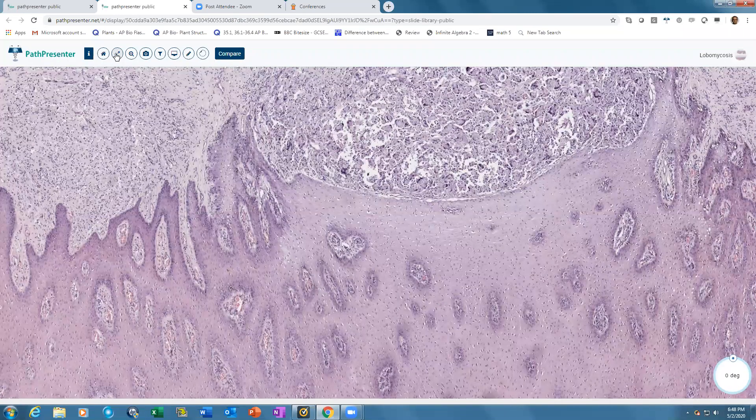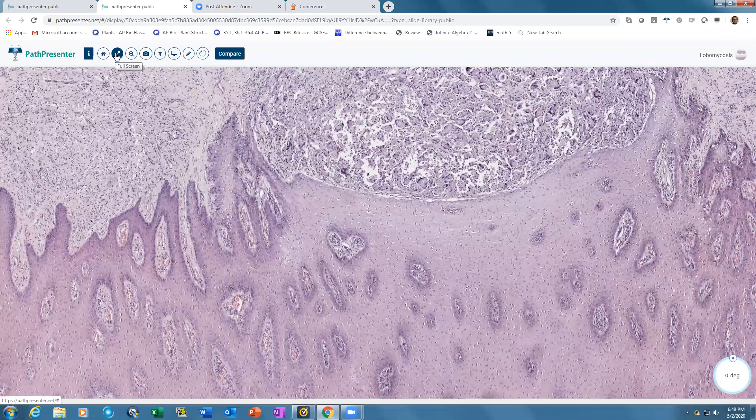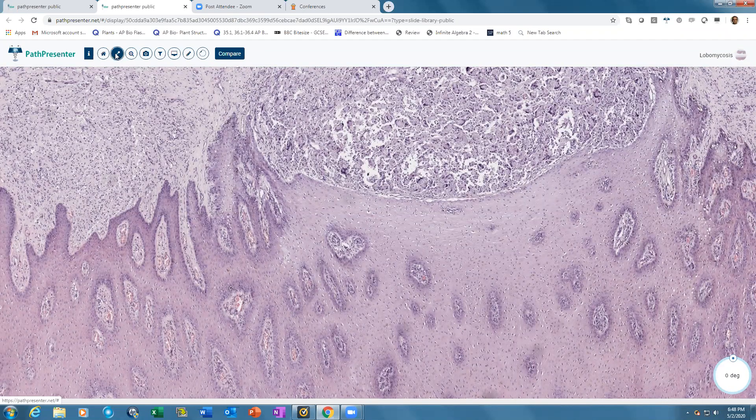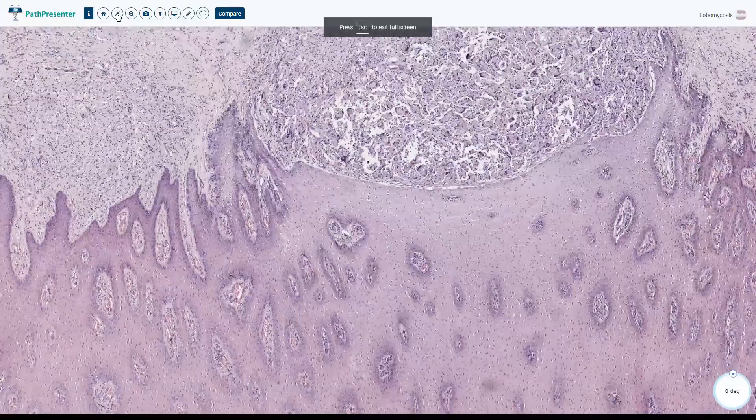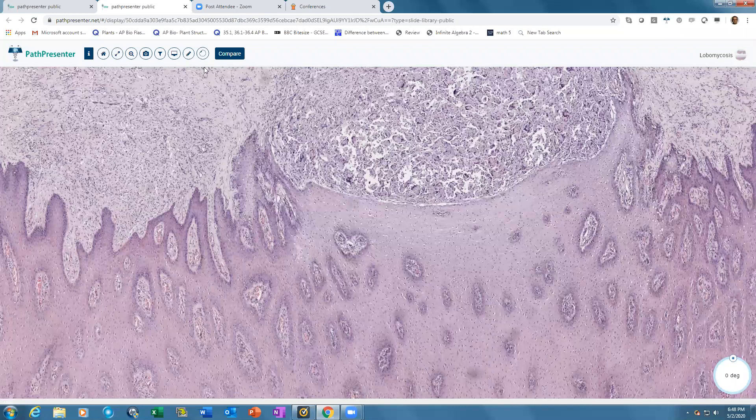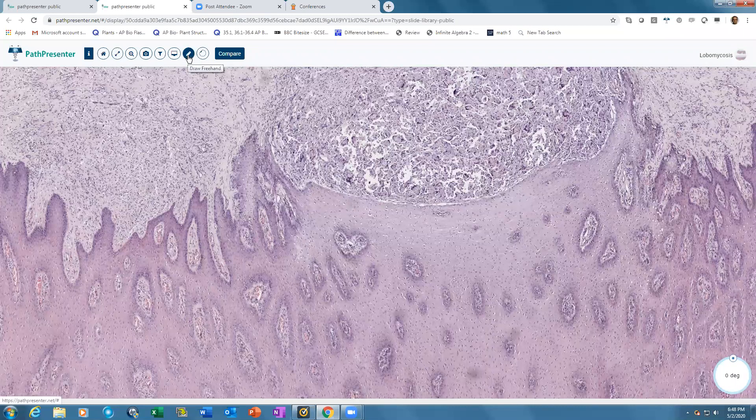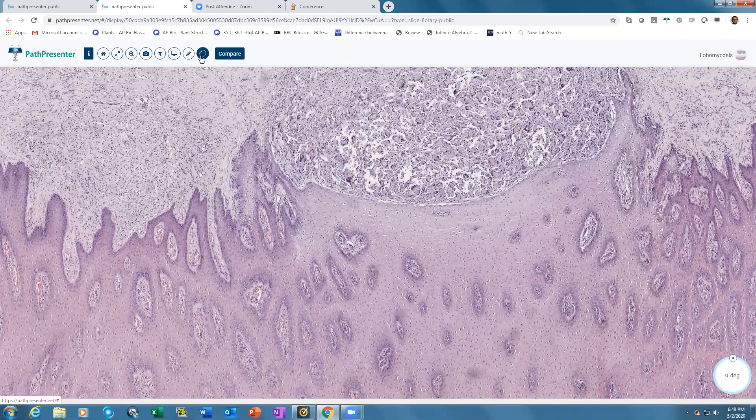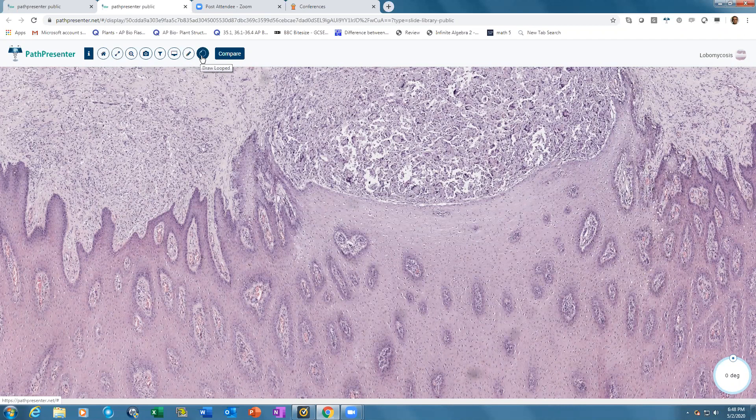The full screen button allows you to make the slide full screen. The rest of the tools allow you to annotate either freehand or draw looped annotations when teaching from the slide.